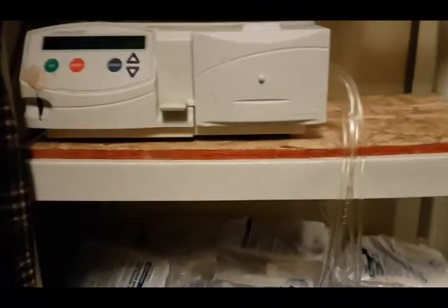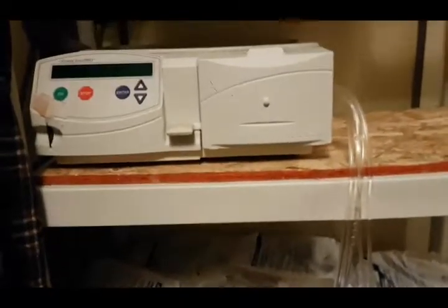Every night he has to take his temperature and weigh himself, and when he's changing caps or hooking up, he has to use one of these masks just so everything's sterile, there's no germs or anything, just so that we can avoid the potential for the nasty infection as mentioned earlier.